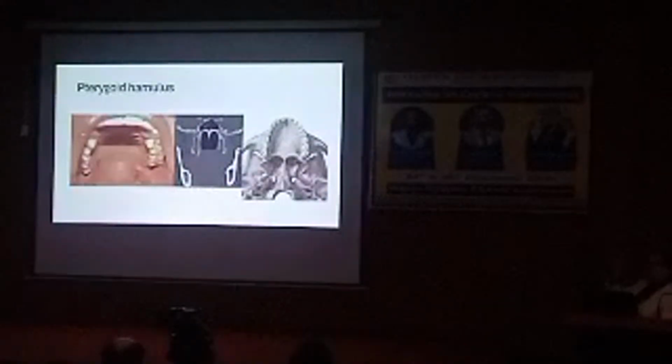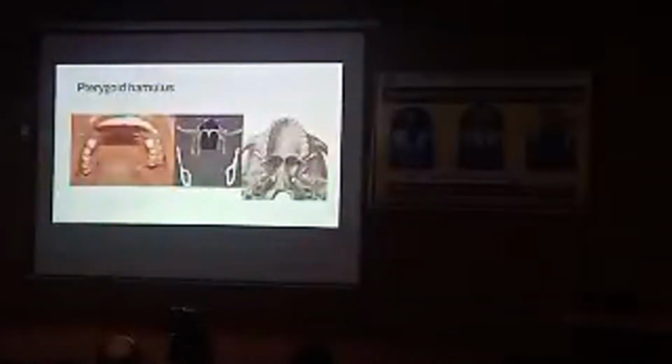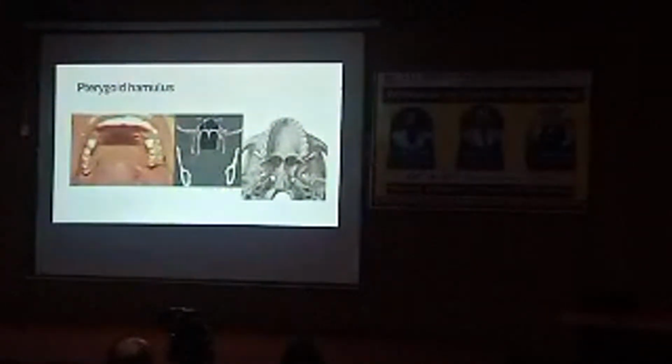And instead of using only the drill, there is a handle, over which you put the normal average drill with which you are drilling. The tuberosity is very cancellous, very spongy, so you perforate it by hand. When you perforate it and you reach the pterygoid pillar, the fusion zone, beyond that you will not be able to go with hand pressure, and that is pterygoid tapping. Where you do this, you push your pterygoid handle into it and you will not be able to push it beyond that. It means you will feel a wall-like resistance. It means you have found the pterygoid.